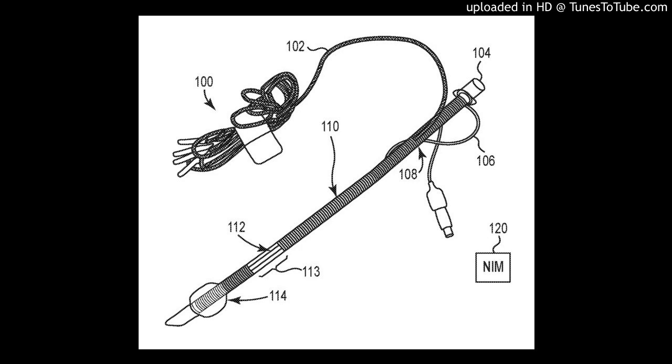At least one wireless sensor is formed on the endotracheal tube, and is configured to wirelessly transmit information to a processing apparatus. Endotracheal tubes include electrodes that are designed to make contact with a patient's vocal cords to facilitate electromyographic, EMG, monitoring of the vocal cords during surgery when connected to an EMG monitoring device. Endotracheal tubes provide an open airway for patient ventilation, and provide for monitoring of EMG activity of the intrinsic laryngeal musculature when connected to an appropriate EMG monitor. Endotracheal tubes can provide continuous monitoring of the nerves supplying the laryngeal musculature during surgical procedures.